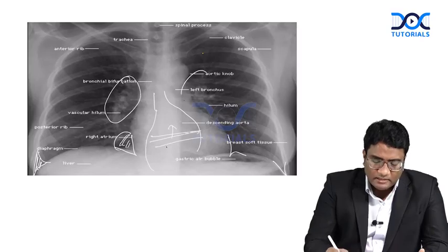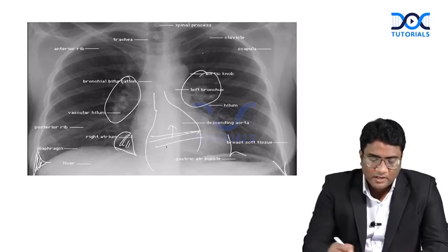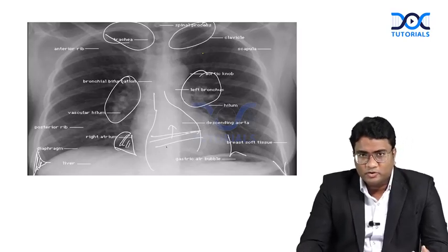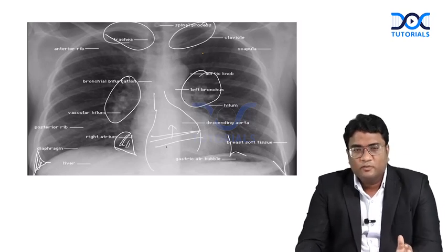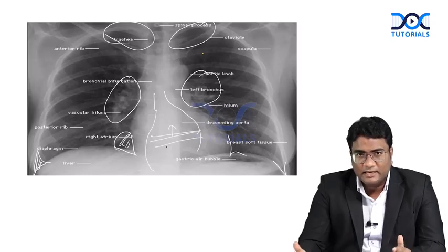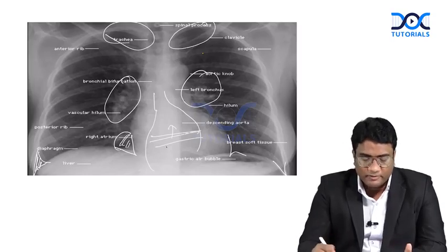Look at the hilum again. Do not confuse whether it is a prominent hilum or a hilar mass. Look at the lung apex again. You may be missing a Pancoast tumor or tuberculous foci, right, which are in the apical regions. So look at these areas once again. So what are the review areas or hidden areas of chest X-ray? The CP angle, the retrocardiac area, the hilum and the lung apex. Look at them again so that you are more confident about it.